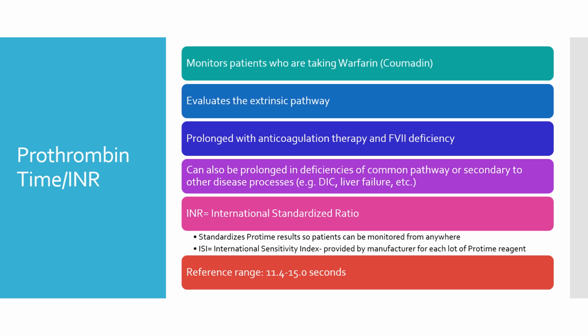And this ISI takes into account the differences in methodologies, and then a calculation in the ratio form standardizes that, taking into consideration those testing differences.